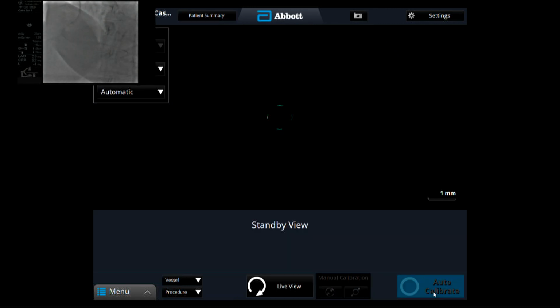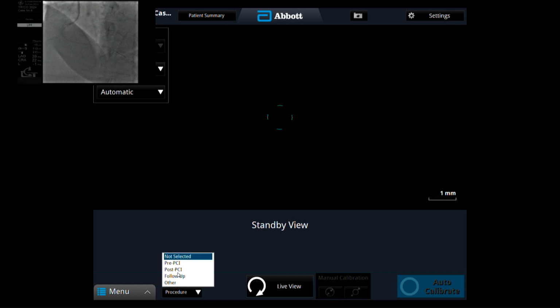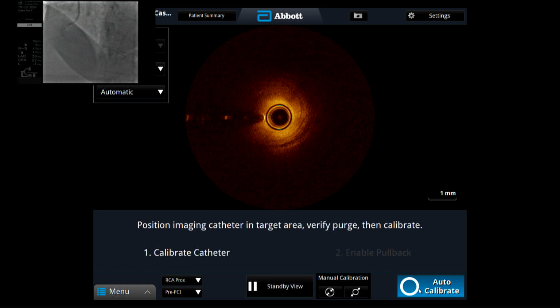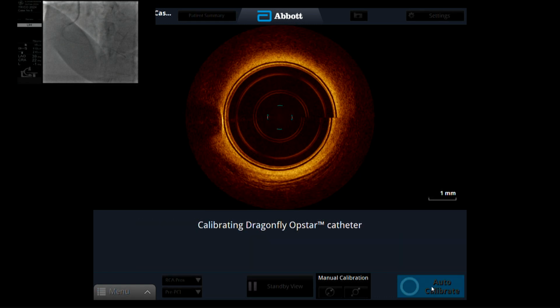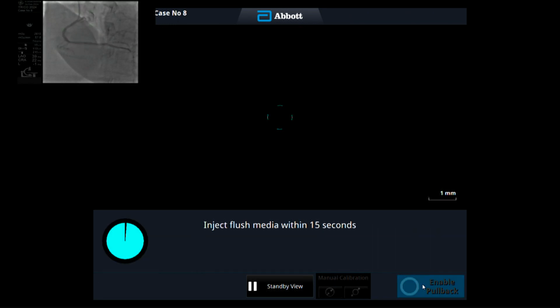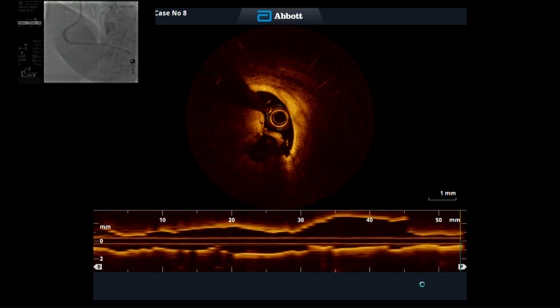Okay, we have one there. So 2 shoots? Yeah. Okay. Go quickly. We'll take 2 shoots, and go on high definition mode. Okay. Beautiful. Crystal is okay. Quickly.